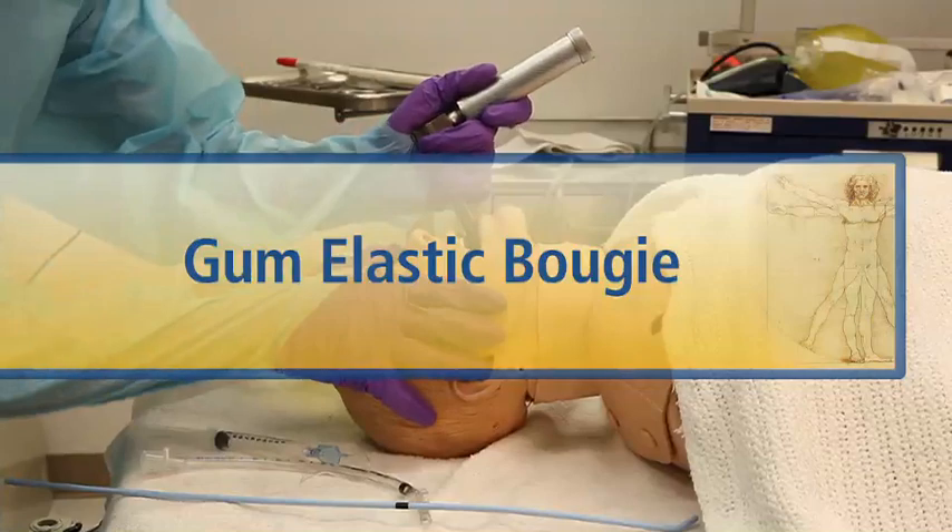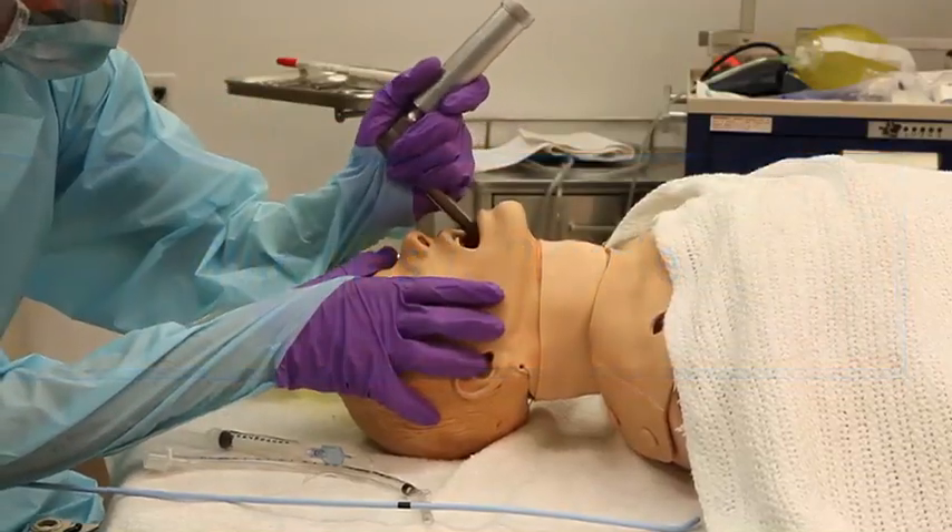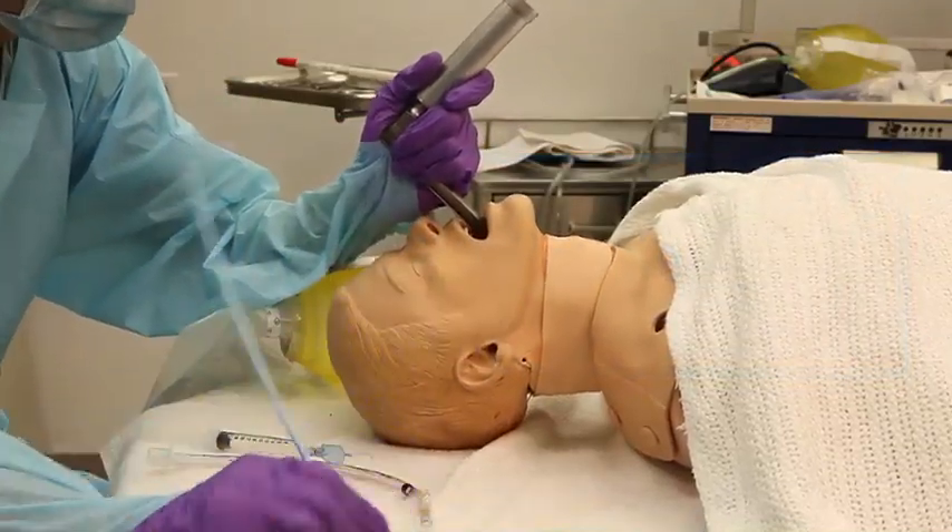Following normal endotracheal intubation guidelines, sweep the tongue to the left and visualize the landmarks as best you can.